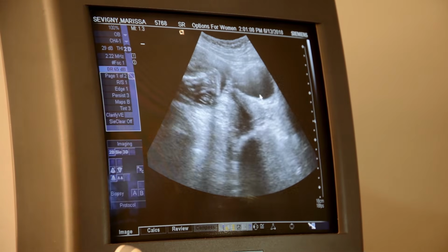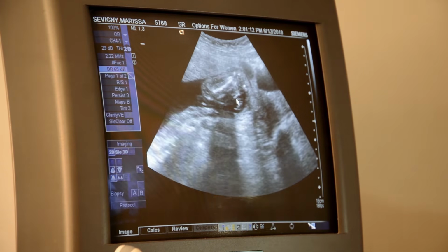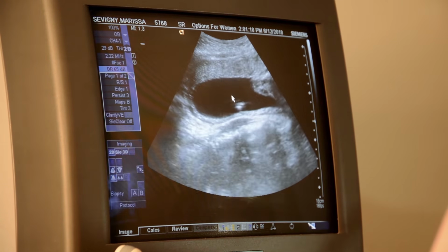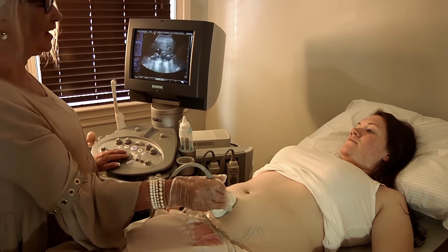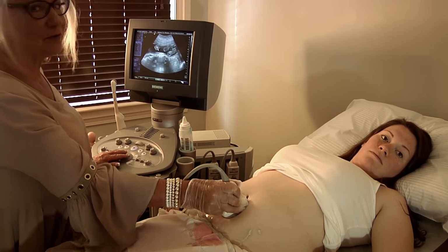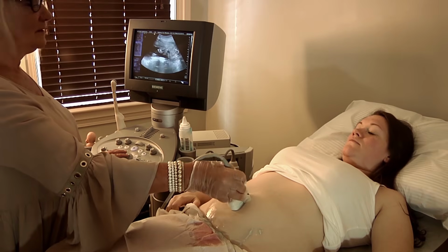So Lauren did a beautiful job. She showed the bladder, cervix, vaginal canal, lower uterine segment. She took that. Then she went up to the fundus and grabbed the fundus. Now, again, I want to mention, when you're on the mother's belly, do not push hard. Look what happens when I push hard. I push in on the space, okay? You want to lighten up, okay?